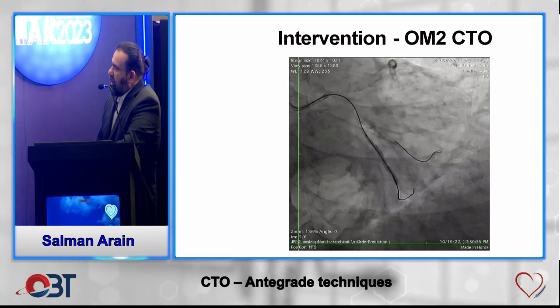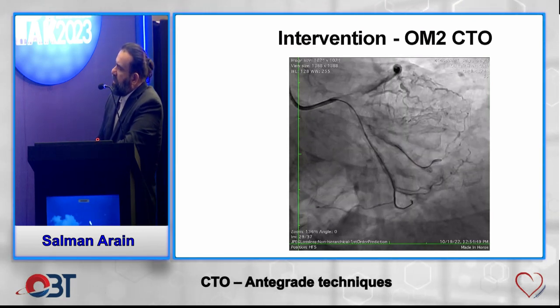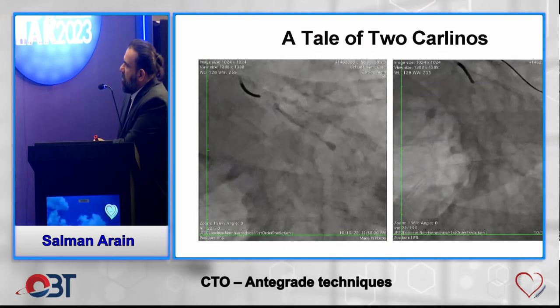And this is the second branch, it came here. Okay. And we ballooned it, and this is your second OM that opened up, which is actually just as large as the first one. But what I want to focus on is this part.